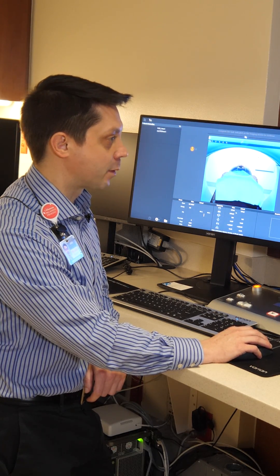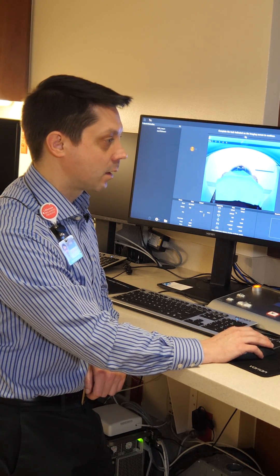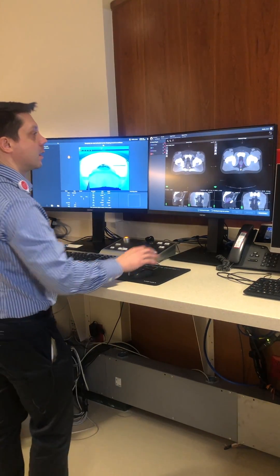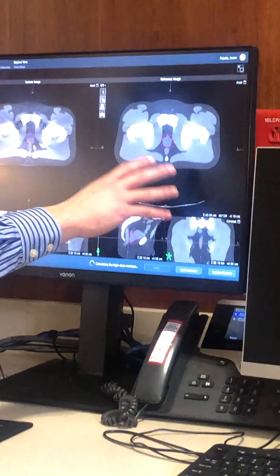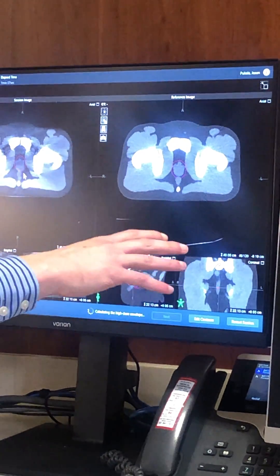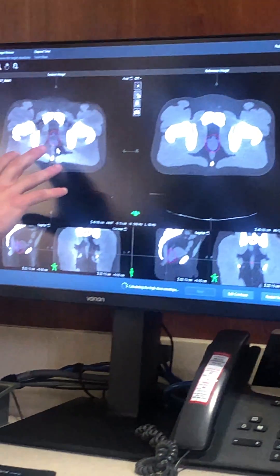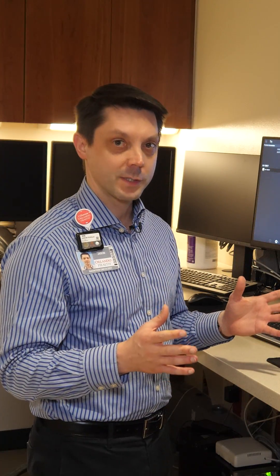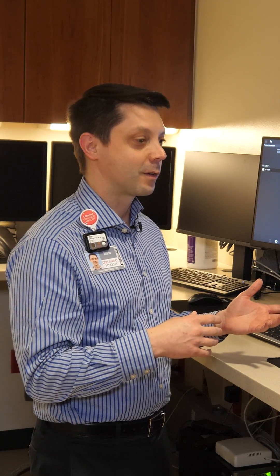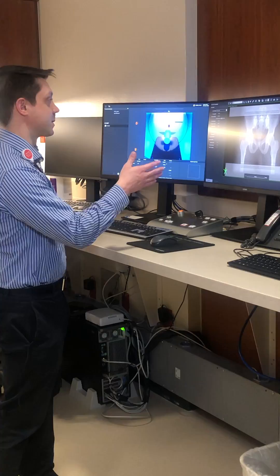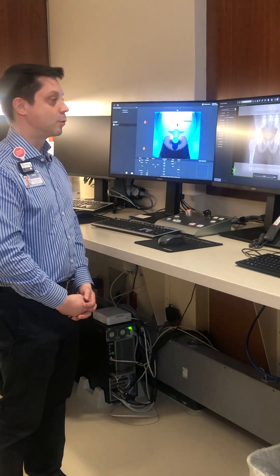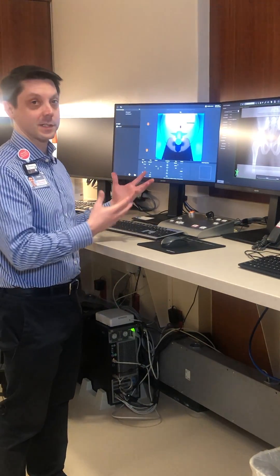Once we review those contours — and we can edit and adjust them here on the fly — these are auto-generated by the system. What we're seeing here is our original treatment plan on the patient's anatomy from their first CT scan, and what we're seeing on this side is the patient's anatomy for today and how that might have changed. For all the different body sites where anatomy might change, we can make adjustments on the fly for that patient's treatment, which we can't do on our other machines — and that's what this technology allows us to do.